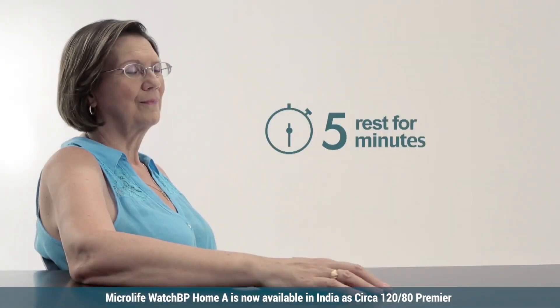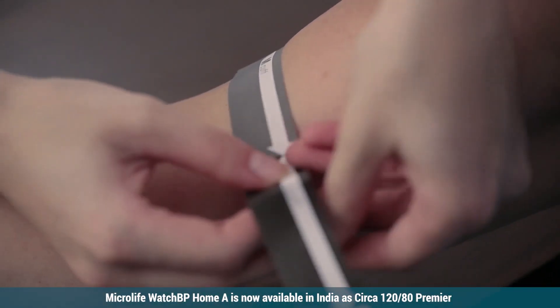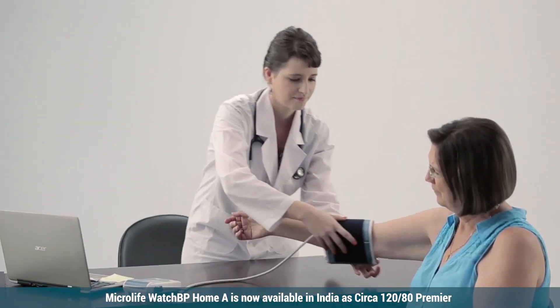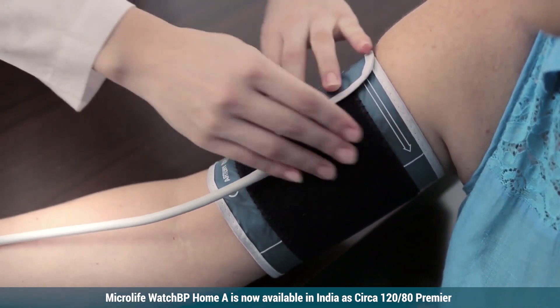Take 5 minutes rest before beginning blood pressure measurement. Choose the correct cuff size. Make sure the lower edge of the cuff is exactly 2-3 cm from the inner fold of your arm.